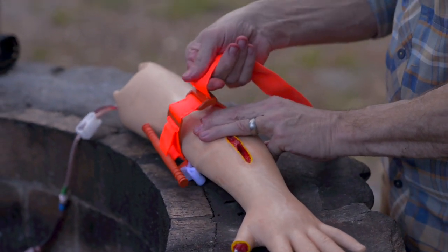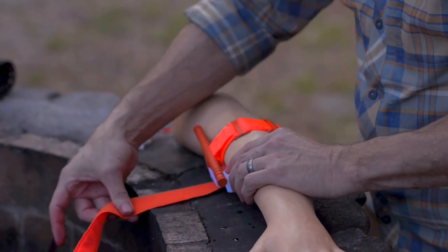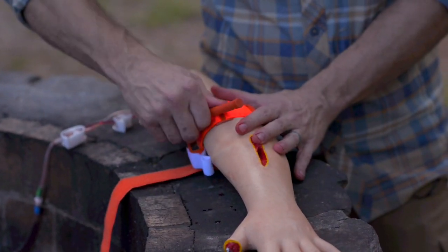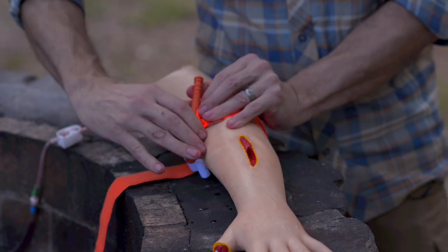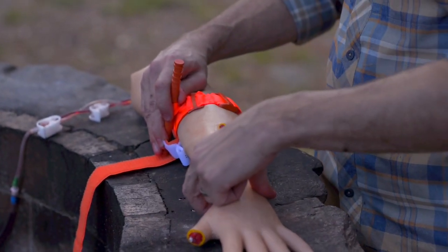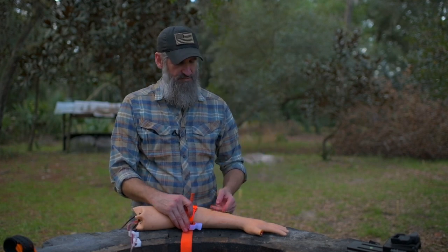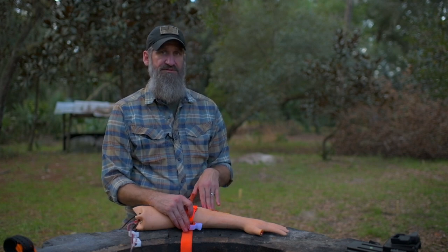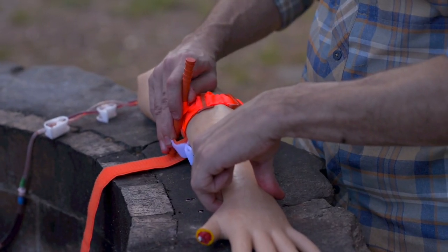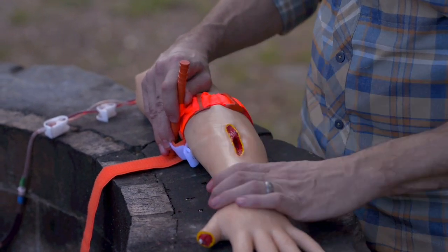Take out all the slack and secure the strap without tightening the windlass yet. Then turn the windlass until the bleeding has stopped and you no longer have a distal pulse — those are the two things you're looking for. Even if visible bleeding stops, there could still be retracted arteries causing blood loss, so check the distal pulse to confirm blood flow is occluded. The pulse should be absent. If bleeding has stopped and there's no distal pulse, the tourniquet is tight enough.